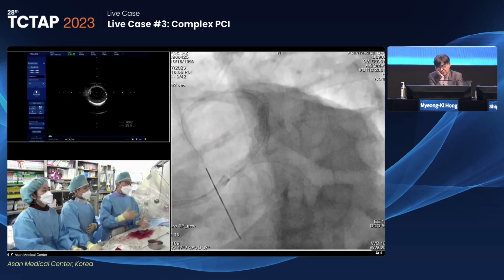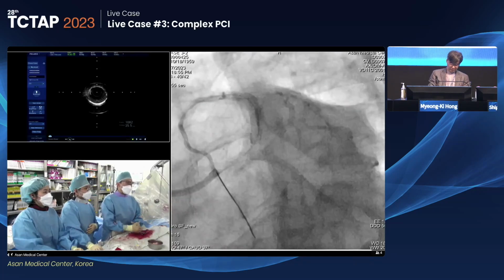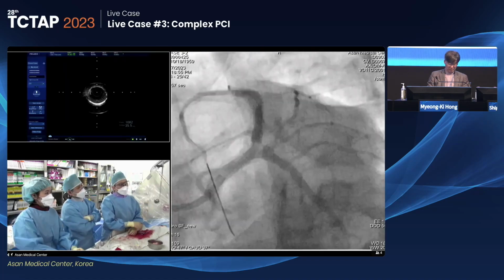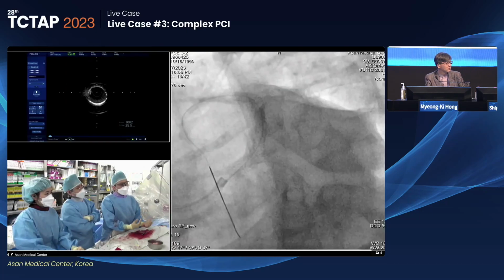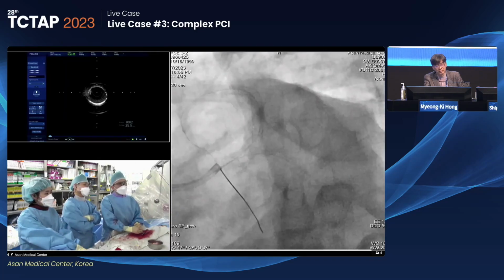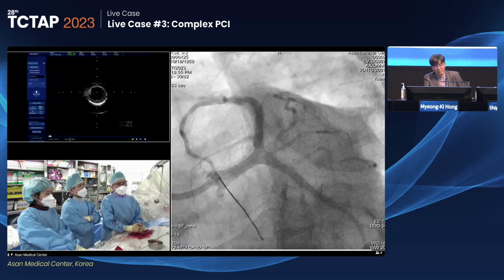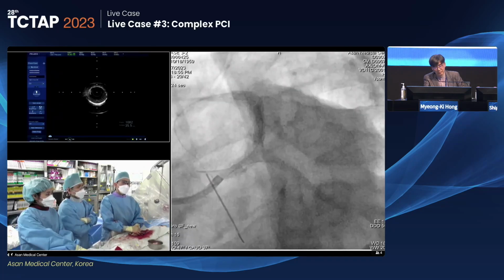However, there is very severe calcification, especially outside compression, and I opened it as big as possible, but there is some hematoma and haziness. But I think I have cared for the patient well, and after some time, with a long DAPT, he will recover well. However, if the patient recurs again, then CABG would be a good option, because we always have the escape of not doing very complex PCI for a high-risk patient.